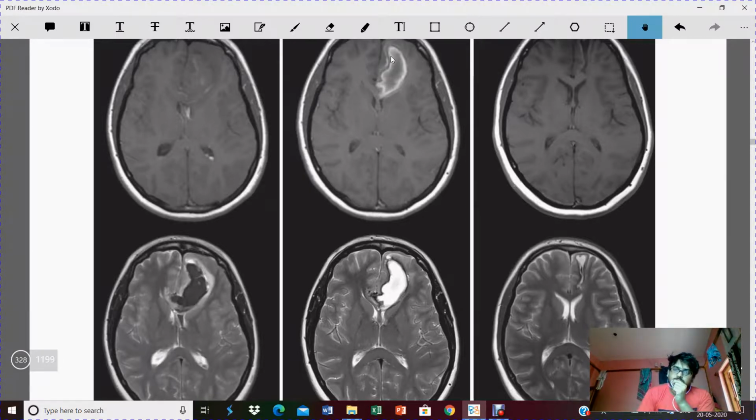In these cases there is peripheral hyperintense. This is a patient in subacute stage, early stage. In this condition there is hyperintense. So methemoglobin came out of the cell and it produced the hyperintense. This is the late stage of the subacute stage. In these cases we also discussed.